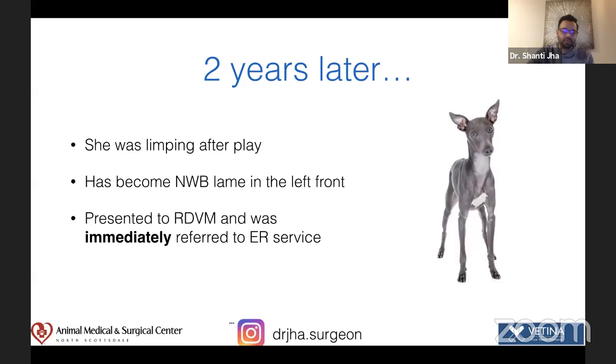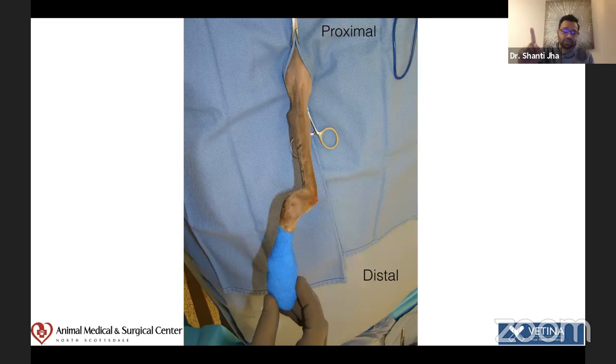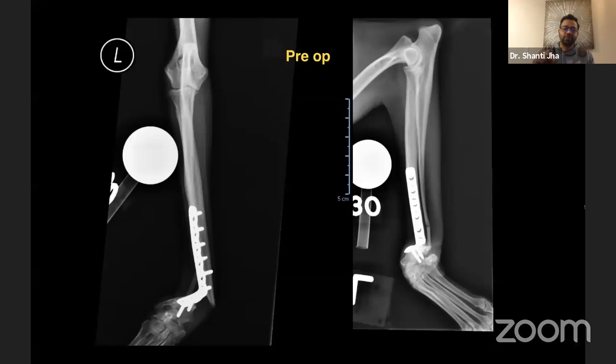This is what was happening, guys. You can see the leg, proximal and then distal, I'm holding it. It is turned 90 degrees. That's what is happening. The plate failed at the fracture site, which wasn't healed properly. It was just somehow stable. And you can see complete elastic, plastic deformation there.